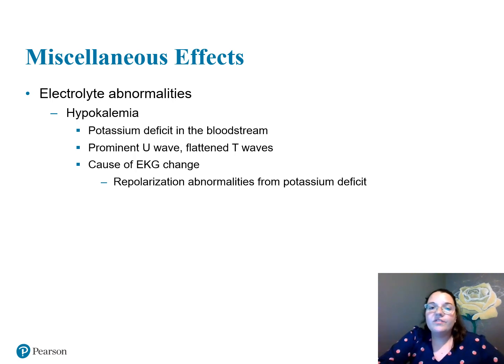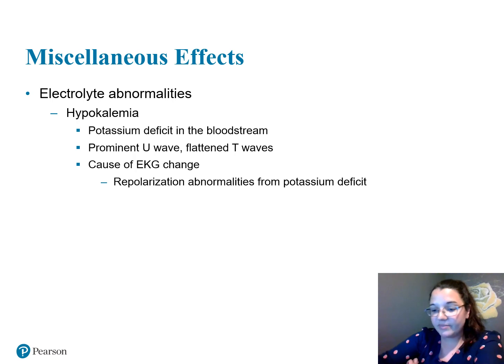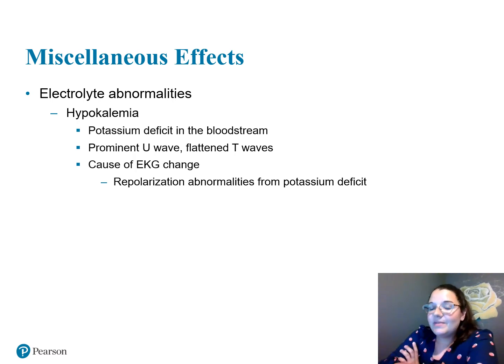All right, so if we have hyperkalemia, then it's natural that we're going to have hypokalemia. Medical terminology, right? It means my potassium's low in the bloodstream. This is where we're going to see that very rare U wave. Your T wave is going to be flat. This can cause a change in your EKG, repolarization abnormalities from potassium deficiency.